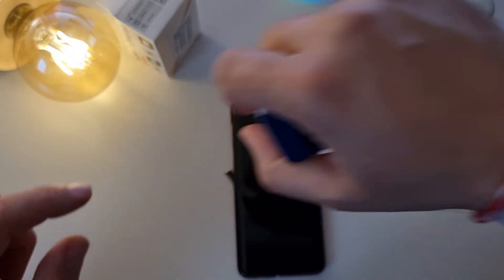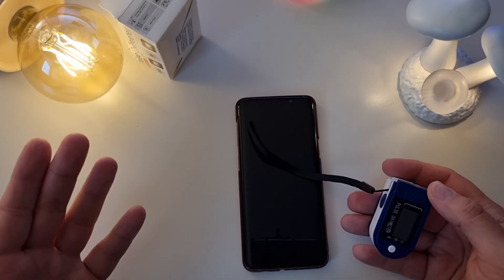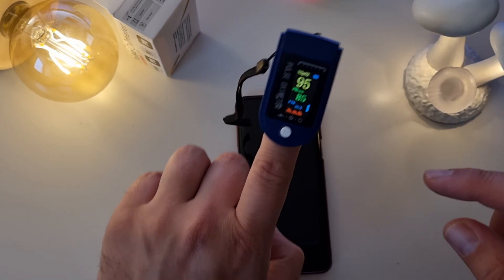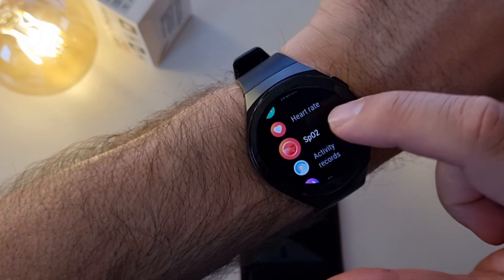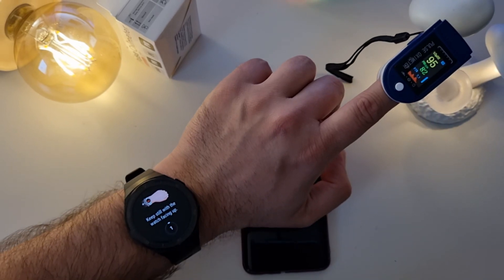So we're going to do this great comparison. First, I'll take another measurement with the oximeter while not speaking, just to see what it tells me. The result is 95. At the same time, I'm going to use the Huawei Watch GT2e — you just click here, select SPO2, and the measurement starts with a 3-2-1 countdown.